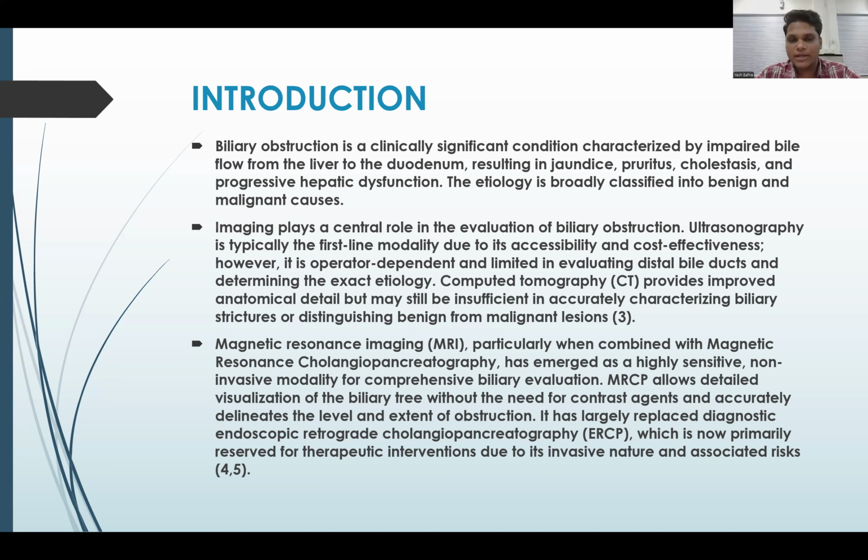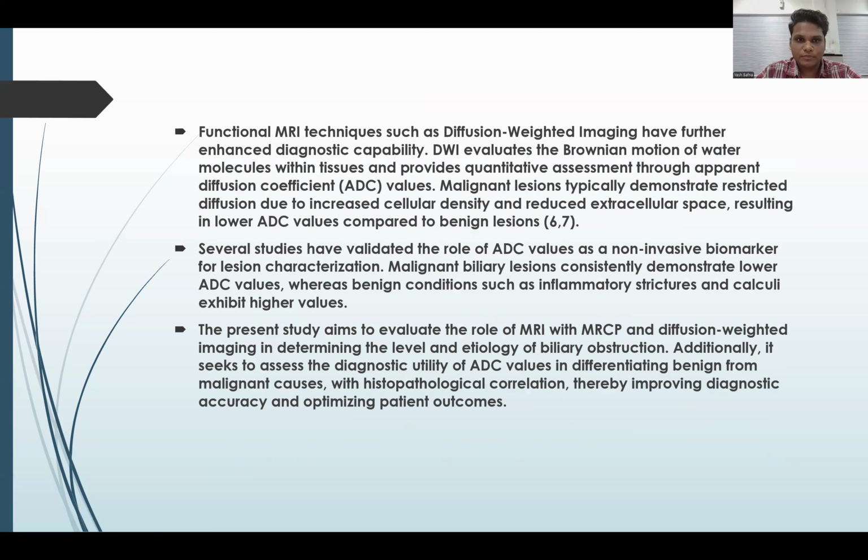It allows detailed visualization of the biliary tree without the need of a contrast agent and accurately delineates the level and extent of the obstruction. It has largely replaced diagnostic ERCP, which is now primarily reserved for therapeutic intervention because of the associated risk and invasive nature. Functional MRI techniques such as diffusion-weighted imaging have further enhanced diagnostic capability.